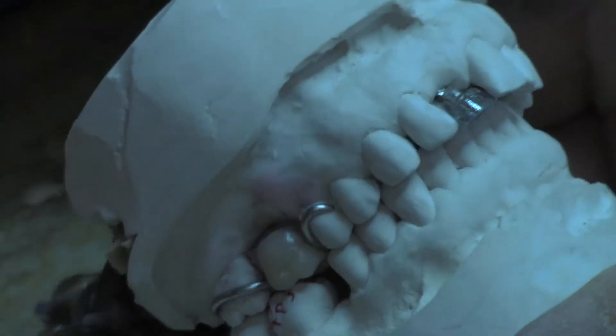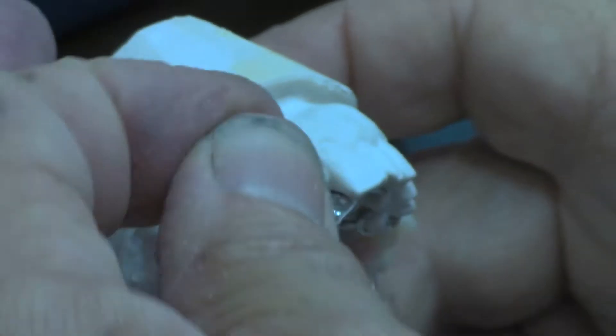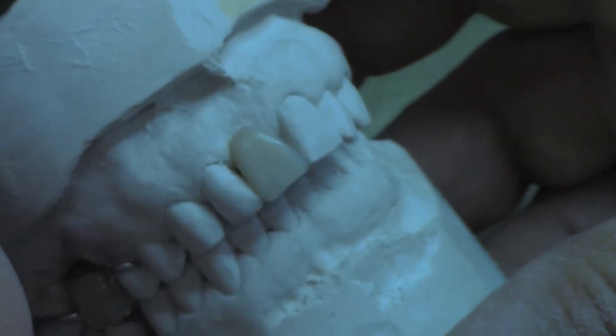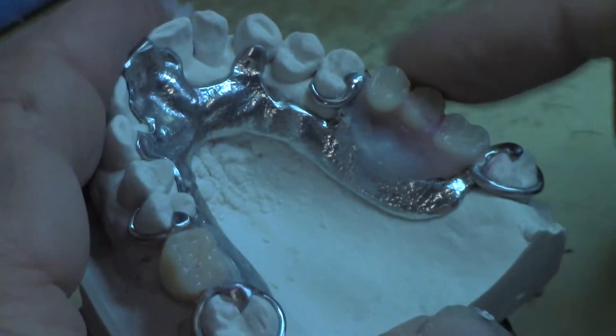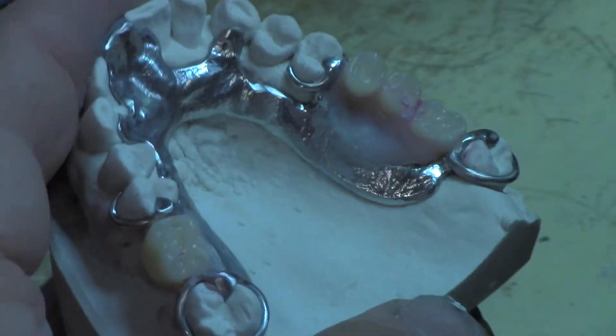I've set the teeth, they're in place. I'm going to wax it up to finish it and flask it to get it all done. But before I do that I'm going to take my acrylic and place acrylic in here, put this tooth in there, and secure it right there. Then I'll flask it, cover all this up, expose the teeth, flask it, pack it. And when we break it out, it'll all be ready to finish.